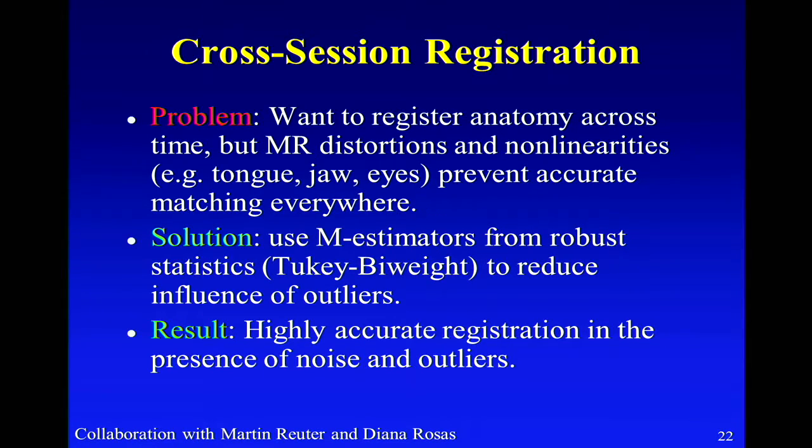So a second question is what we do across session. We would very much like to have our slices be, for example, in the same place across session so that we can maximize our ability to detect changes from one scan to another. There are a couple of problems with this. Even if we try and align across time, the alignment itself is not really a rigid one.